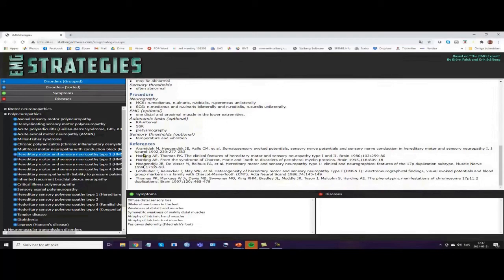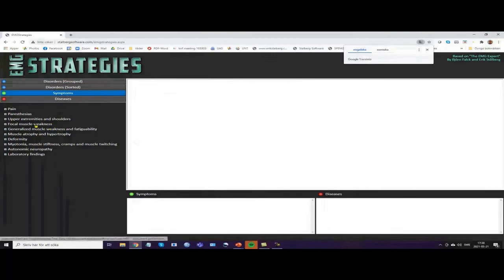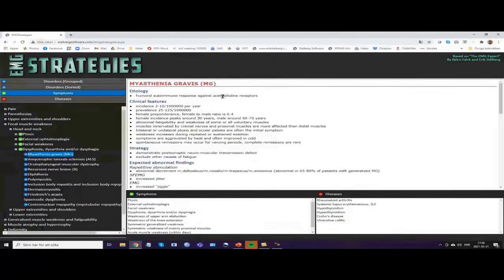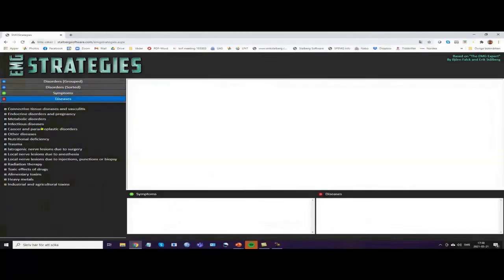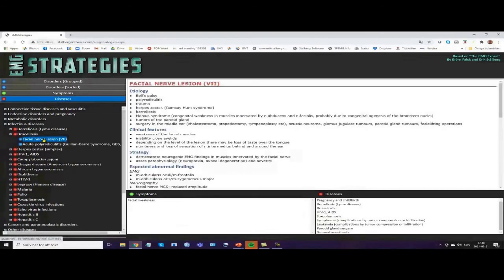We can also sort it according to disorders. We can go after symptoms. We come into myasthenia, or different diseases, infectious diseases, brucellosis, facial nerve in brucellosis.